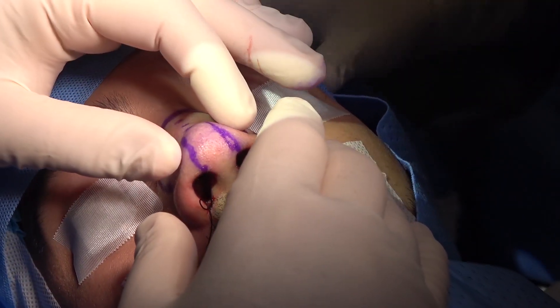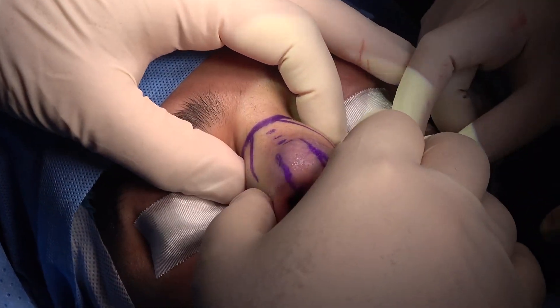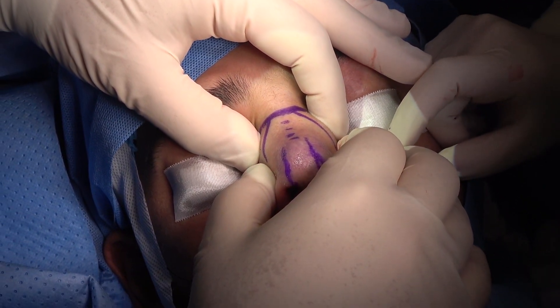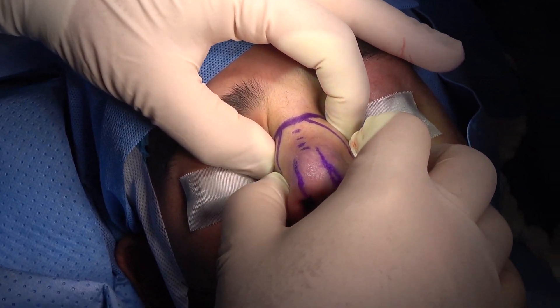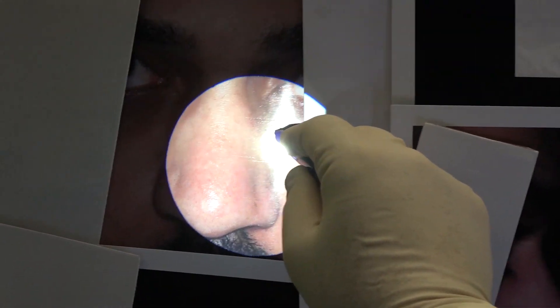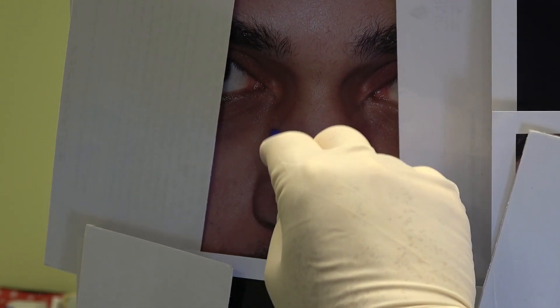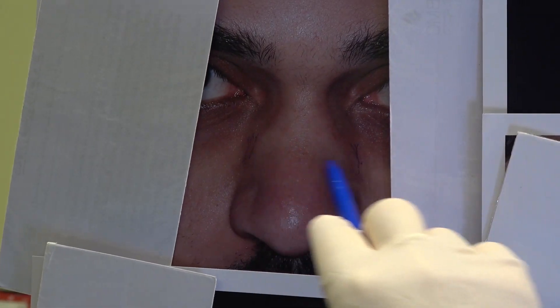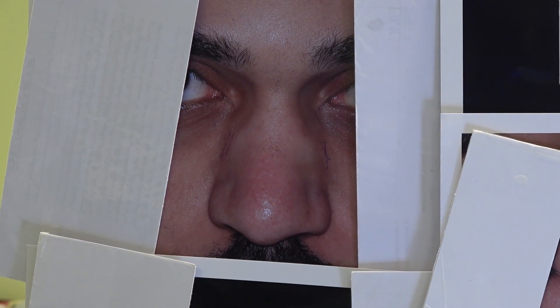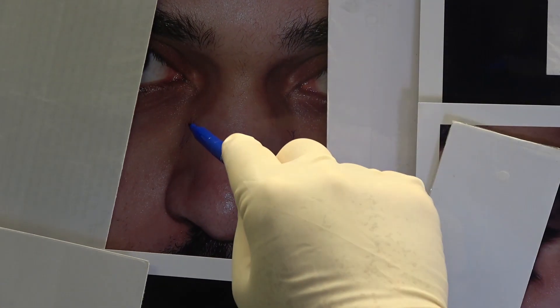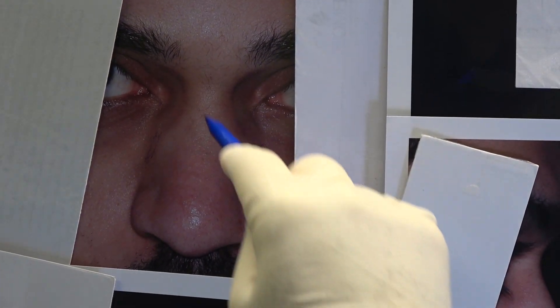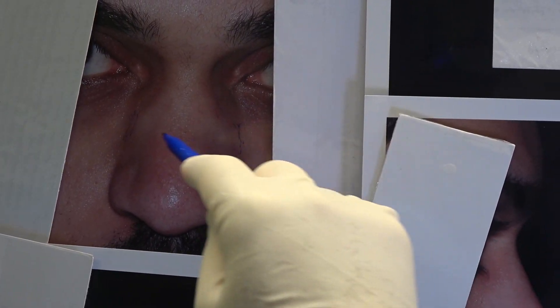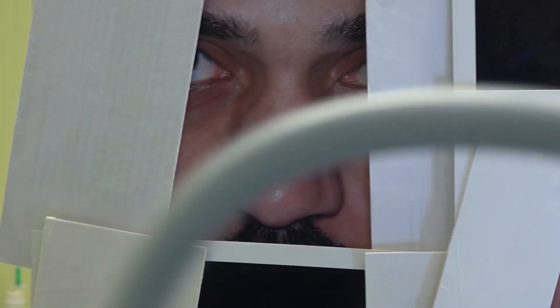Now we are going to deal with the vault, with this wide bony bridge. You see the very wide bony bridge there — the bony bridge starts from there to there. It's quite wide, like a spindle. We are going to make the bony refinement.